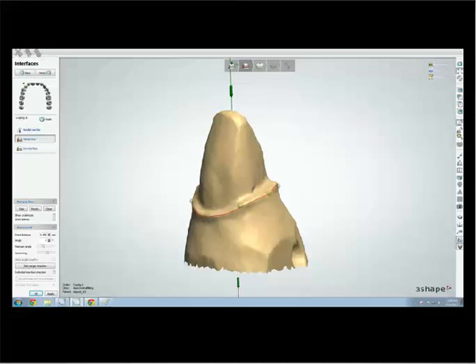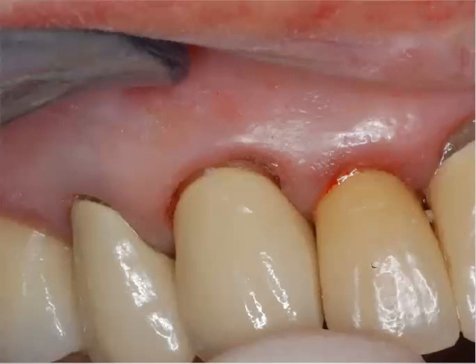And this is then sent to the lab. Now they go through the fabrication process. They outline both the morphology and the construction of the form of that occlusal form, and also the margination. So having that distinct margin is really key and critical to the exact margination that we deem important for the outcome of the case. And when you get it back, I displace that tissue.